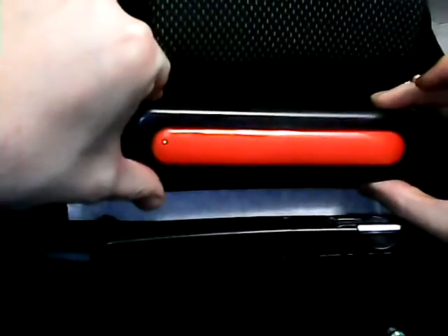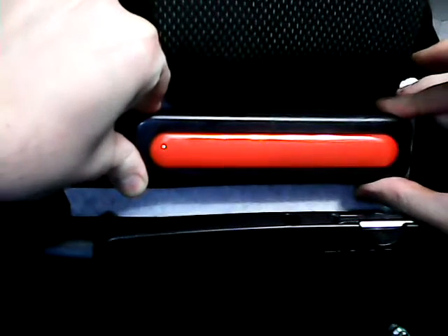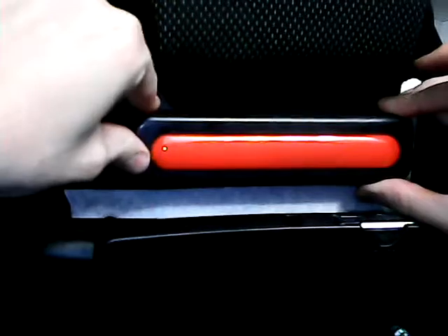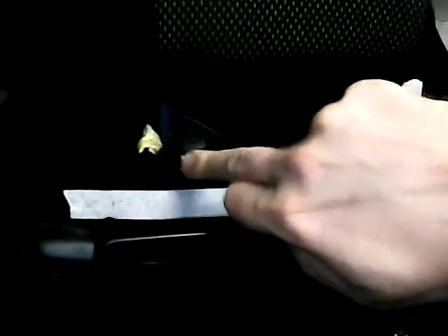Okay, so here it goes onto here. Okay, just like that. Now, the labeling on the adhesive says to give it 2 minutes so that the strength of the glue is maximized. So we're going to do that tonight, so we'll just have a quick inspirational moment with Ron.